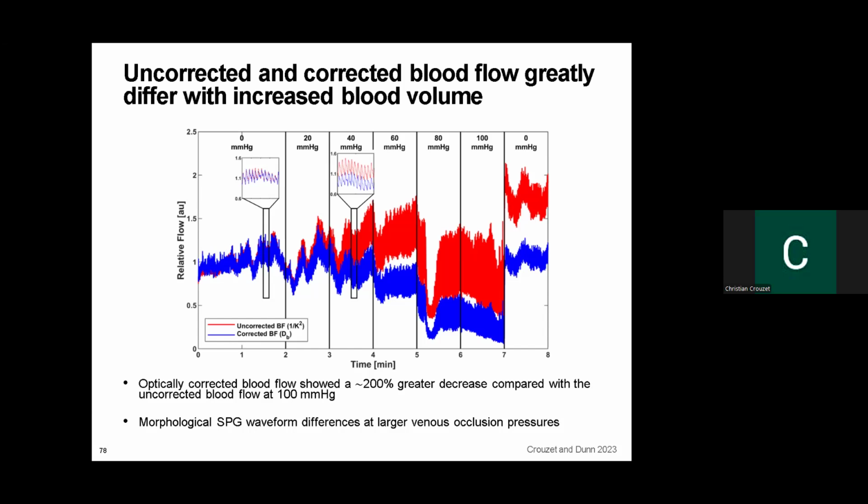The arterial side is continuously going in. But for the uncorrected, it does appear that there's an increase or hyperemic response, but it doesn't seem to, at least, stabilize within this 1 minute period. Where this one appears stabilized, but maybe the uncorrected over time will trend down more closely to the baseline period.